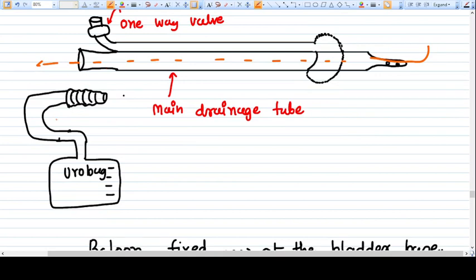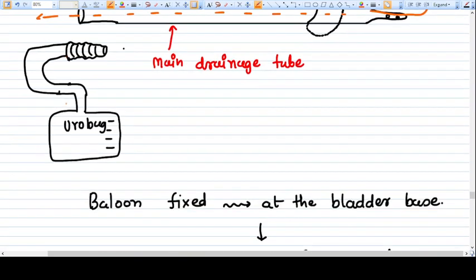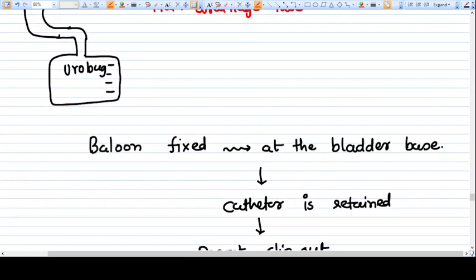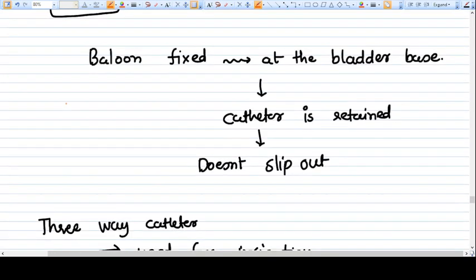The drainage lumen can be connected to the urinary bag or urobag. This is how you drain the urine. The balloon is fixed at the bladder base because when you enter into the bladder, then only after you need to inflate the balloon. When you take it out, because of the weight or gravity, the balloon is fixed to the base, so the catheter becomes retained and doesn't slip out.